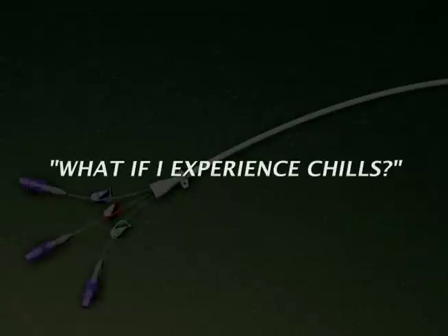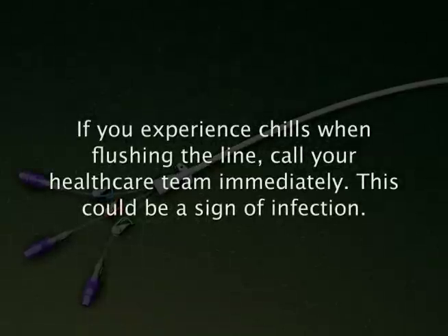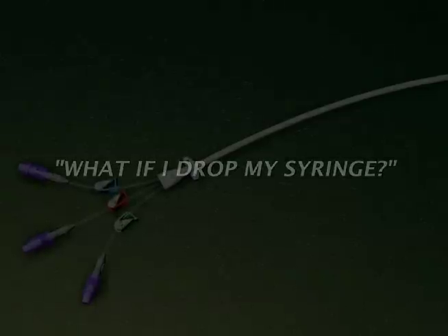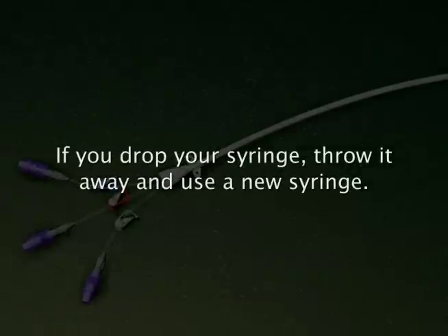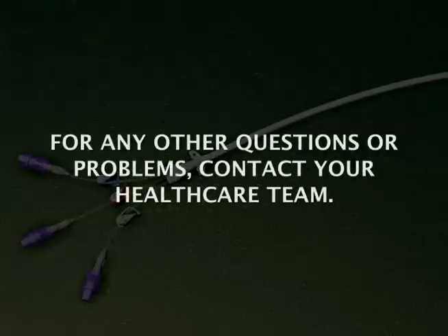What if I experience chills? If you experience chills when flushing the line, call your healthcare team immediately. This could be a sign of infection. What if I drop my syringe? If you drop your syringe, throw it away and use a new syringe. For any other questions or problems, contact your healthcare provider or healthcare team.